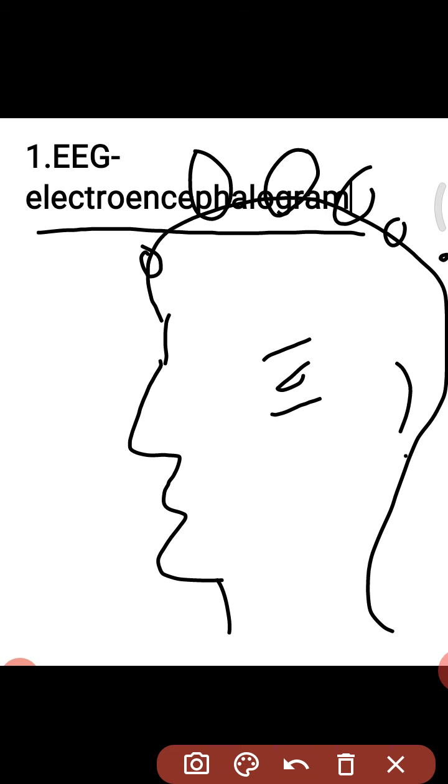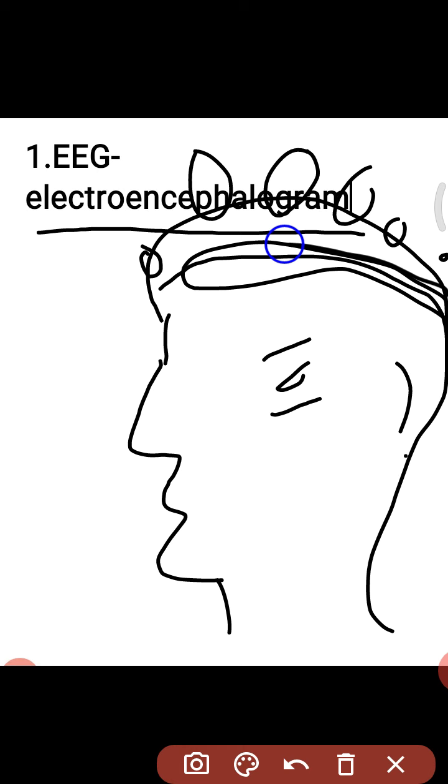Rhythmical potentials are generated by the brain. These potentials originate from the individual neurons of the brain. The waveform pattern complex is termed the electroencephalogram. Millions of cells discharge synchronously and generate different potentials from the neural activity of the human brain, which we measure by using the electroencephalogram.